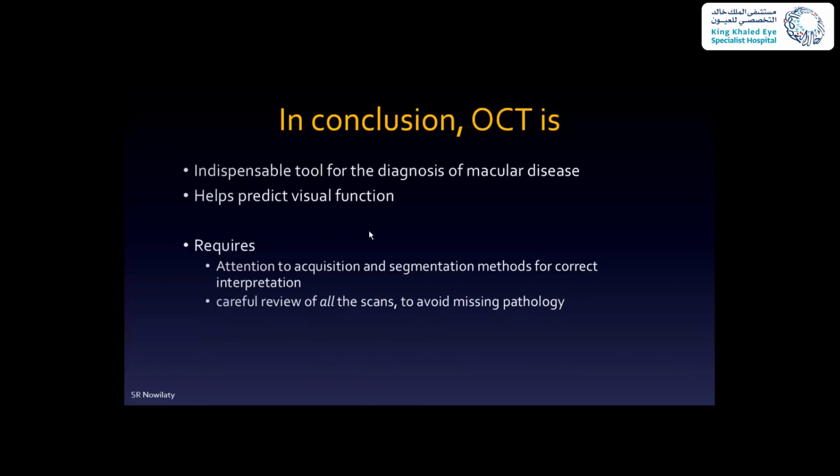And of course, when you treat patients, you follow them with OCT to see if your treatment is helpful or not. So of course, in order to interpret and to use the OCT, you have to pay a lot of attention to the technique.